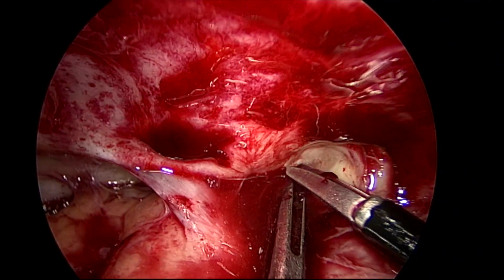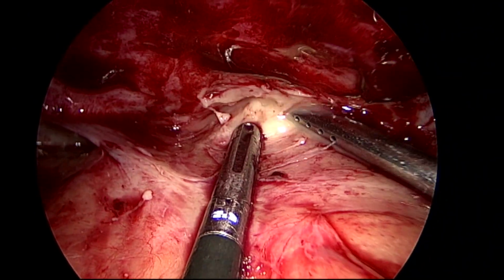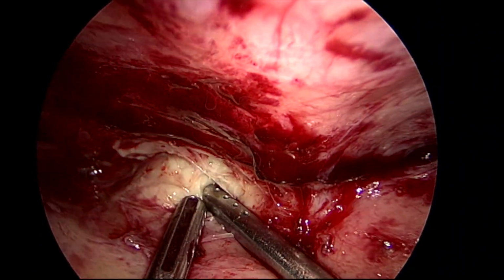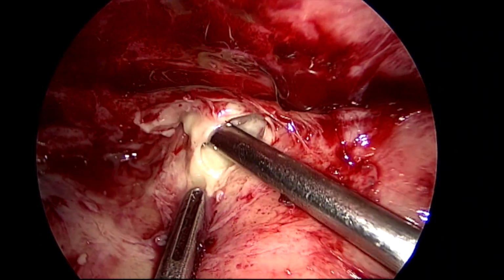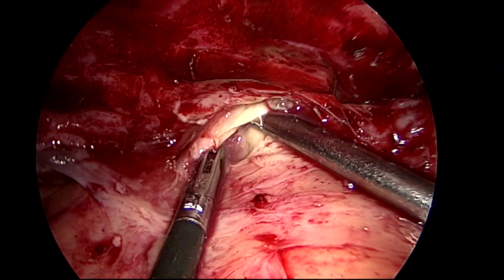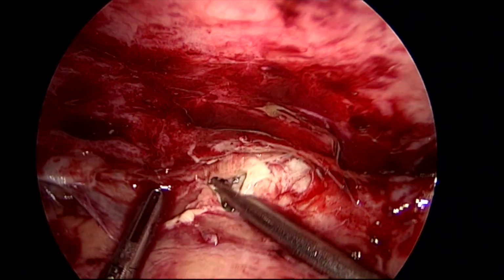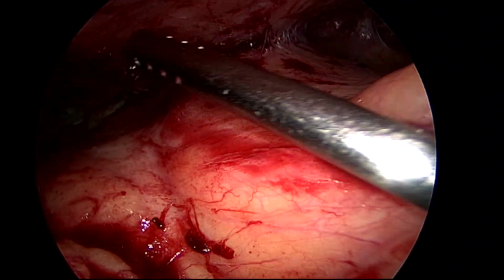A lot of adhesions are there. So I'm using a suction nozzle. I'm going close to the gallbladder area now. It is a perforated gallbladder and sealed according to the imaging. CT shows perforated GB and then sealed. So I'm expecting a collection there.